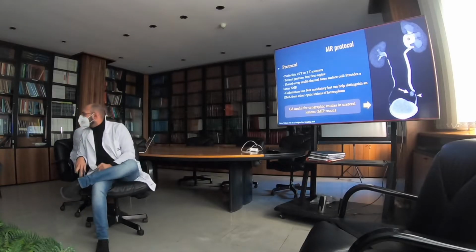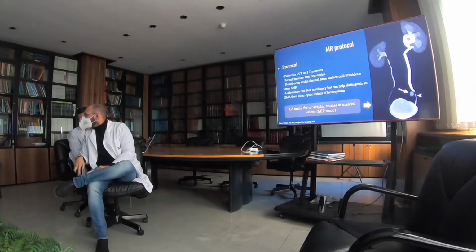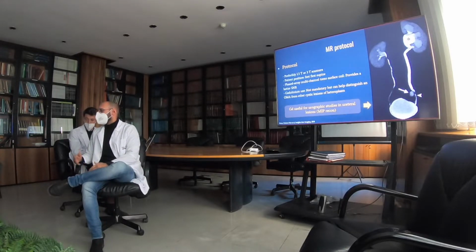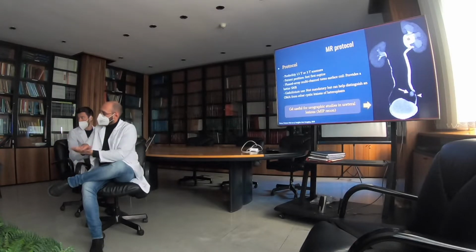Sorry, it could be useful to use both supine and prone position in some examinations. Yes, of course, because the examination can also necessitate the use of gadolinium, which means that after 10 to 15 minutes we can do a urographic phase, positioning the patient in the prone position.